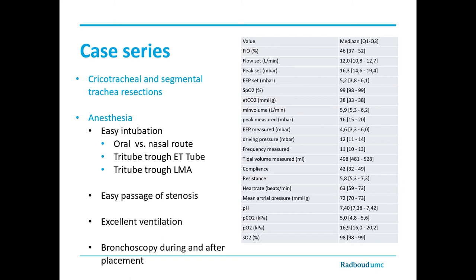We could not include all patients presenting for segmental trachea resections, especially the more distal tracheal pathology gave us difficulty using Tritube. My colleague Guillaume Riese will tell you more about that. But out of 10 patients, we could use Tritube successfully in 8 patients.